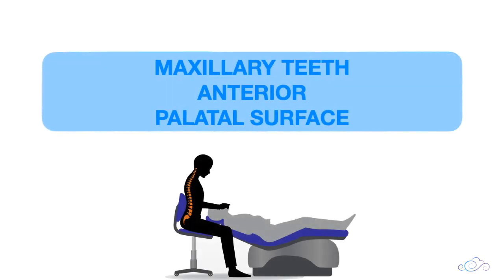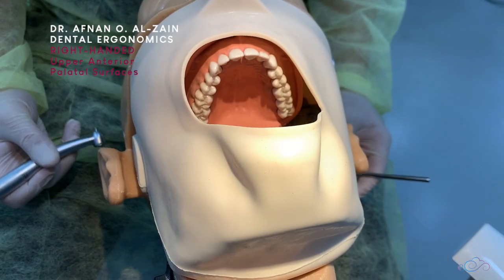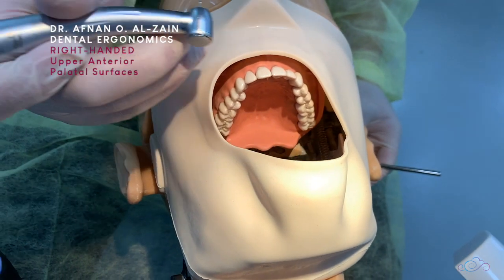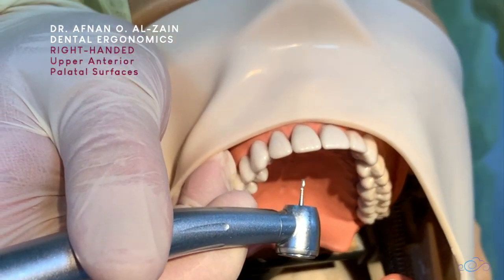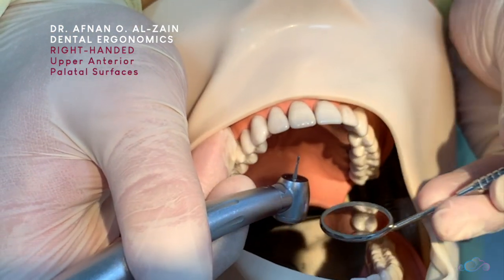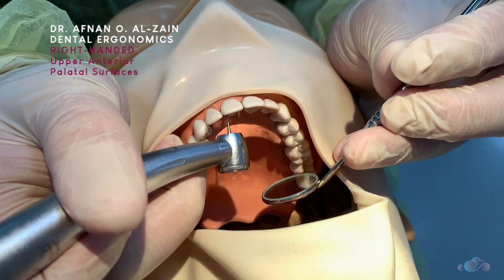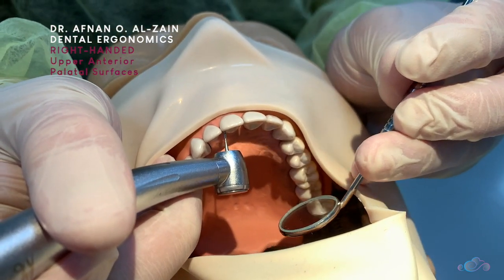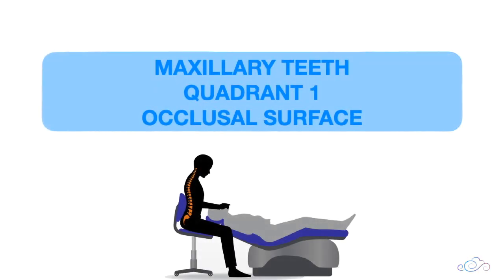For working on the palatal surfaces of the maxillary anterior teeth, you're going to use finger support and keep the patient position supine. Then you're going to use indirect vision — place the burr perpendicular to the surface and use the mirror to see. You can push the mirror a little bit back so it doesn't get soaked.